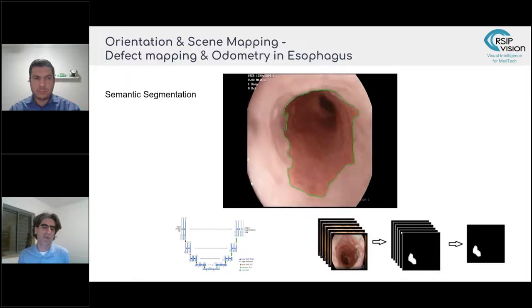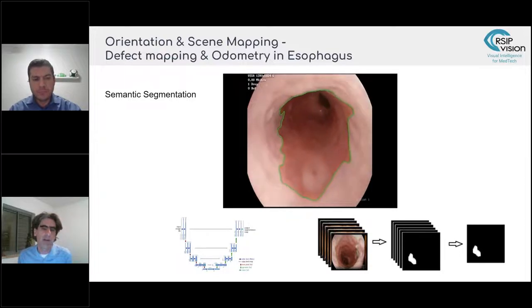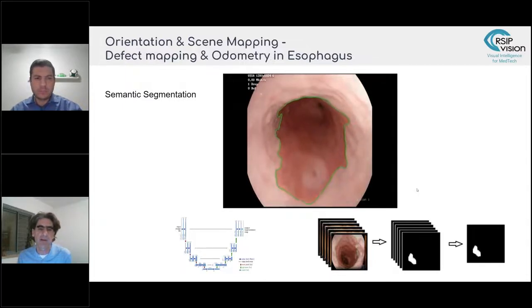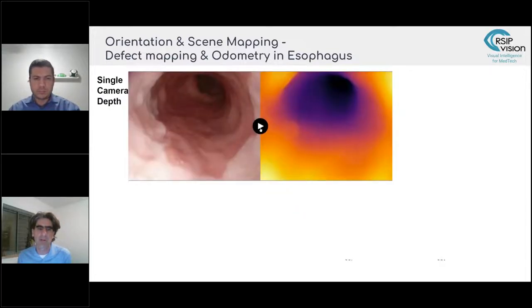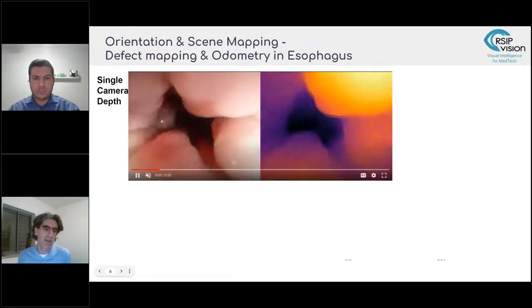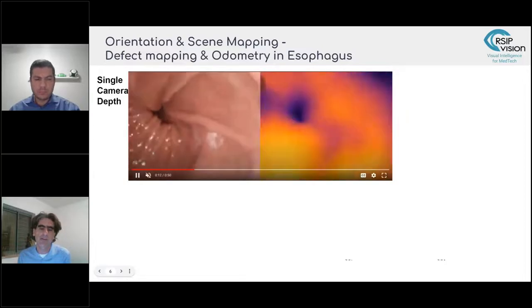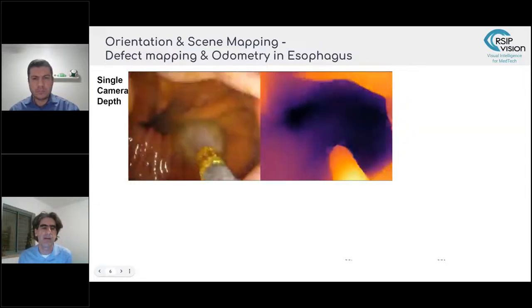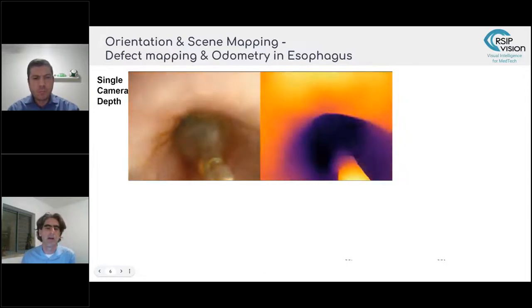Now, this 2D or even 3D, but 3D in time rather than in space, semantic segmentation is only a first step, right? Because now we know where this defect is in our images, but this still doesn't give us a good physical assessment of the defect, which is three-dimensional in the spatial domain. So the next component that's needed to do this type of measurement is to have some assessment of the distance from our camera. In this case, and in many cases, it's just a mono camera, to have some assessment of the depth of this scene, right? So here we're just trying to estimate roughly the size of the lesion and get some correlates to some clinical information. We don't need a very precise measurement in this case, but we do need some assessment of the 3D information.